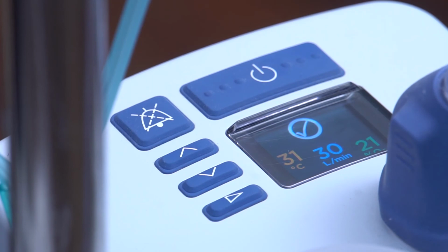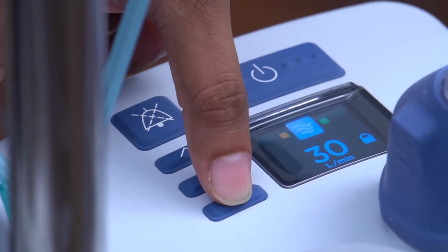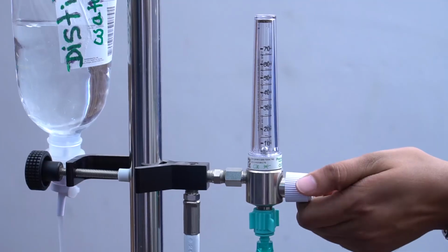The third parameter we are going to control is the fraction of inspired oxygen, FiO2. This parameter is controlled by adjusting the oxygen supply to the machine. This is done by adjusting the oxygen flow regulator as shown here. Normal air contains 21% of oxygen. By adjusting the oxygen flow, we can supply to the patient up to 100% of oxygen.